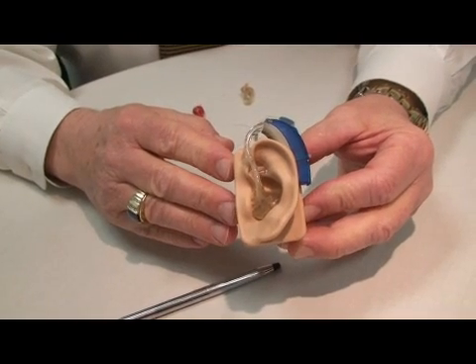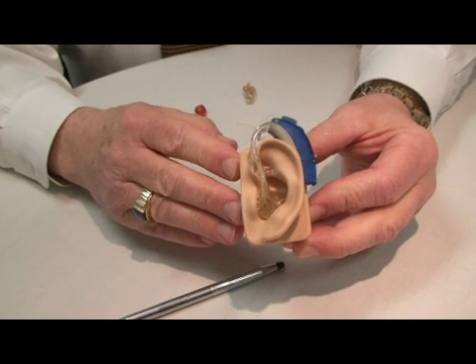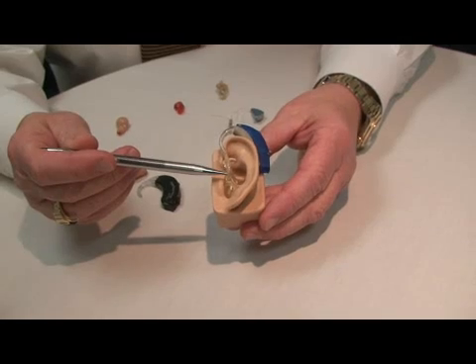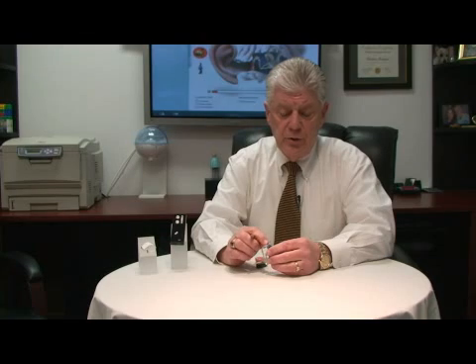Hi, my name is Tom Higgins. In our first type of hearing aid, a BTE or behind-the-ear instrument, we have an ear mold which goes into the ear, coupled to an ear hook which takes the sound into the ear hook and delivers it into the ear through the ear mold.